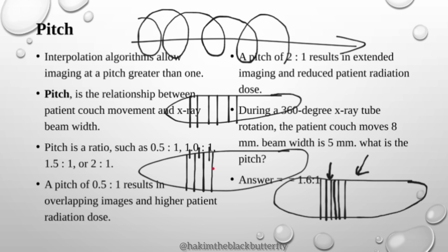For example, patients who have a problem with their brains are making movements everywhere. Also patients who are in too much pain and cannot stay in one position for a long time. So you need to capture images very fast without the patient making any movement.